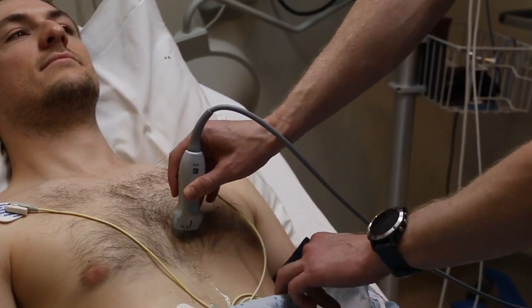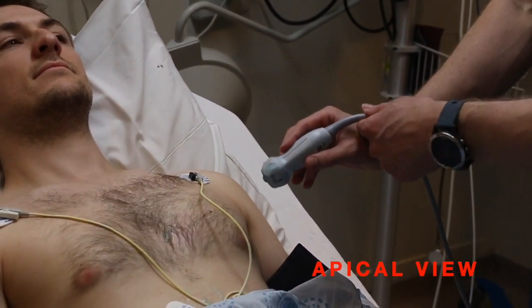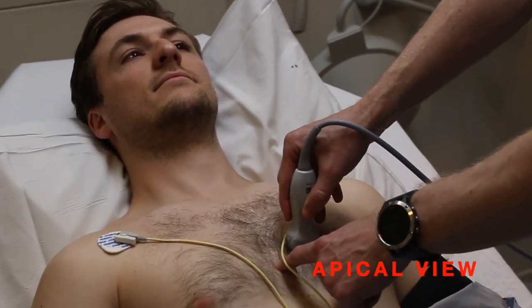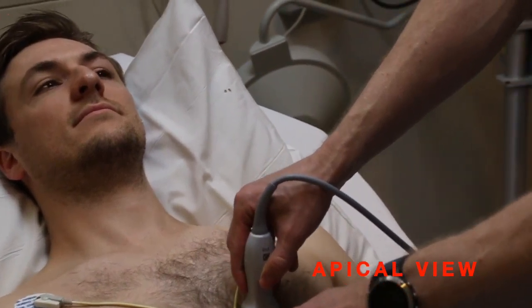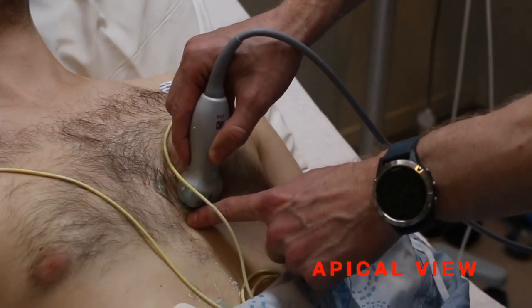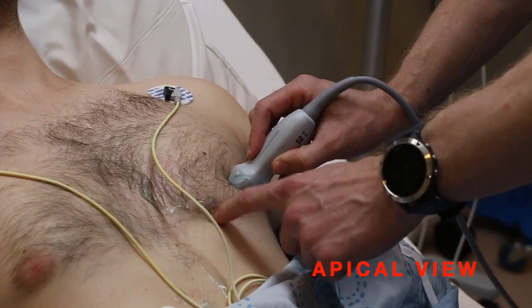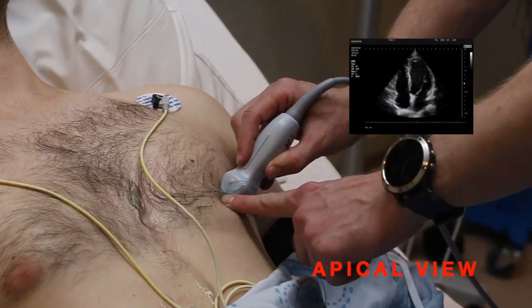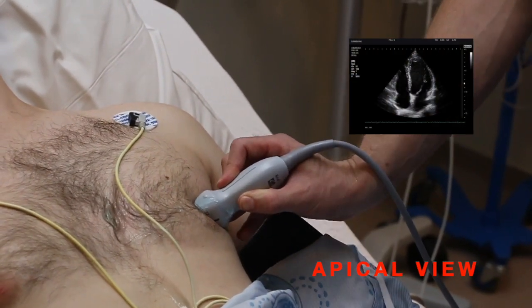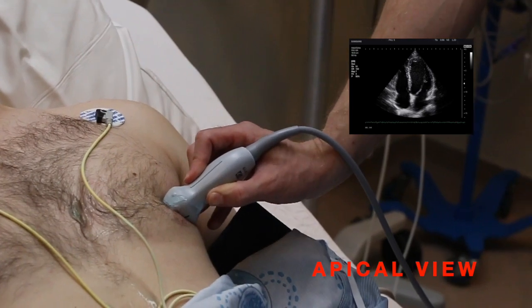The third window is the apical four-chamber view, classically between the 5th, 6th, and 7th intercostal spaces and about 5 cm lateral to the sternum. This view will give you your classic four-chamber view.